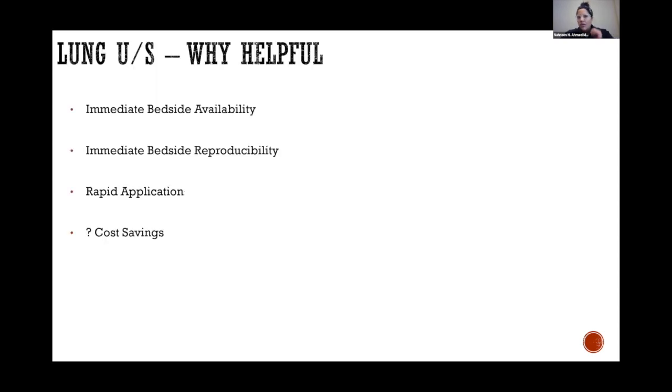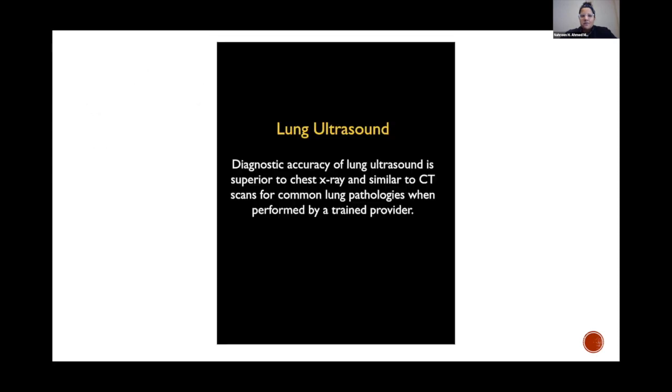So why is lung ultrasound helpful? It's immediately available at the bedside. It can be reproduced multiple times, unlike a chest x-ray or a CT scan, which require a lot more resources. It's very rapidly applicable, meaning if you see a problem, you can address it immediately, and it certainly is cost saving. Lung ultrasound has been studied for several years now.